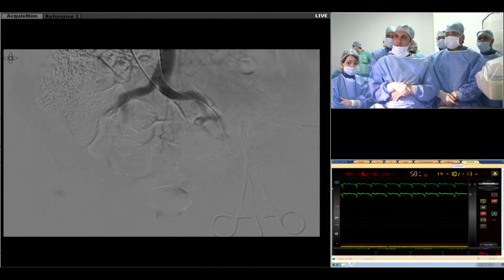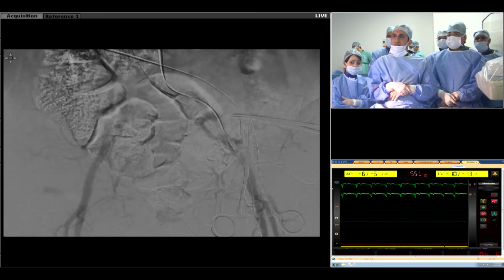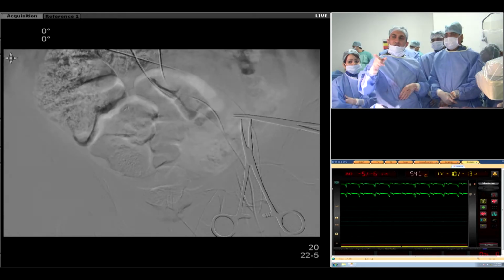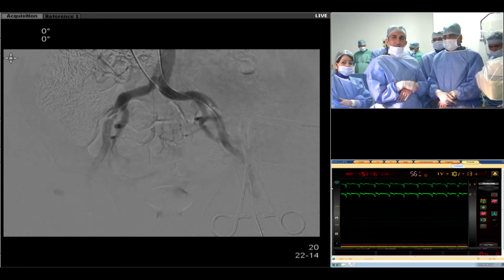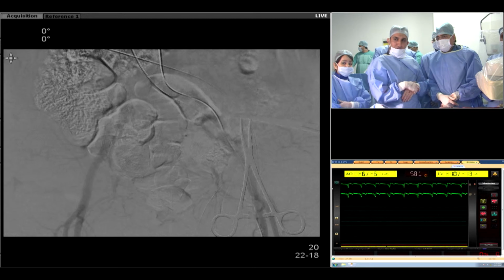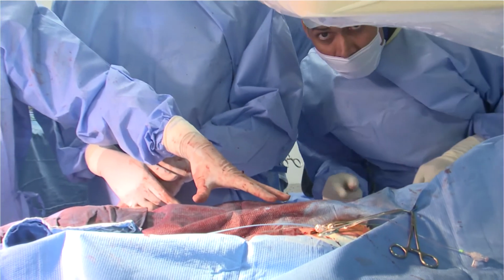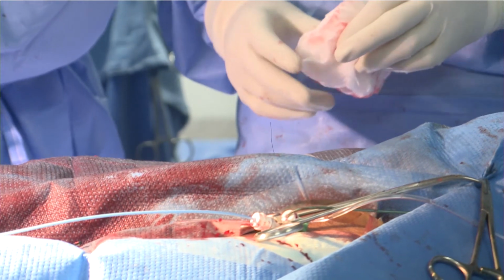Inject. All right, so we can see there is almost no groin complication, no blood vessel complication. You can see a good hemostasis at the common femoral artery, nothing happening at the common iliac, external iliac artery, and I think that's a successful proglide deployment. There's no pinching, absolutely no pinching. So let us focus on the groin here. Using 3 proglides, no extravasation at all.